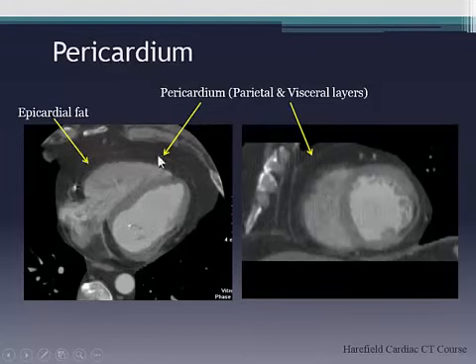So MRI can be very helpful because sometimes even though CT has got better spatial resolution, remember that spatial resolution of CT is about 0.5 of a millimetre, whereas on MR, even if you do a kind of 3D whole heart sequence, you very rarely get less than about a millimetre. But where MR is advantageous over CT is the tissue characterization. So sometimes if you've got what looks to be fluid on CT, you're not quite sure because it's difficult to measure the Hounsfield unit, then MRI can be helpful if you're trying to distinguish whether it's pericardial thickening or if it's maybe some fluid. So always with pericardial disease, I always say you should do a CT and you should do an MR and use the information together, obviously together with echo.